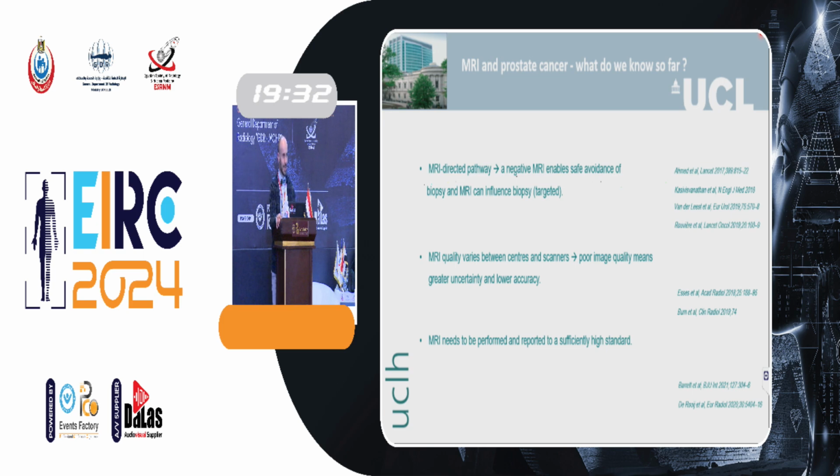In this slide, you can see the history of prostate MRI. The first study on prostate MRI is from 1982, more than 40 years ago. You can see the different timelines and the achievements that have been made. For example, the first study on DCE sequences with contrast is from 1993, and the first study on diffusion is from 2002. This is a scan from 1987. You can see how a prostate looked nearly 40 years ago, but today we are much luckier because we have good quality images like this one. You can clearly see the difference, right?